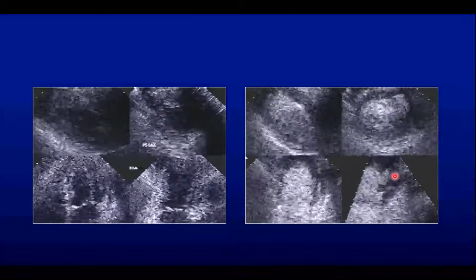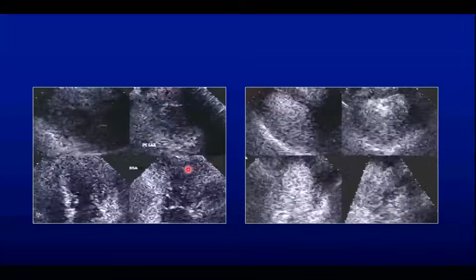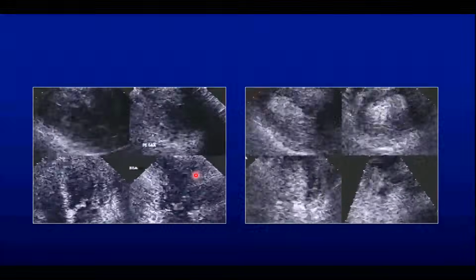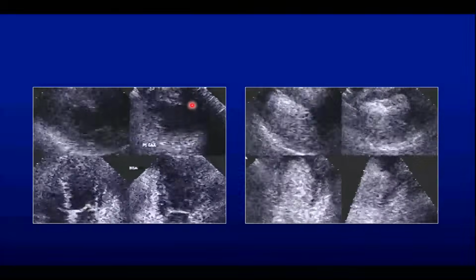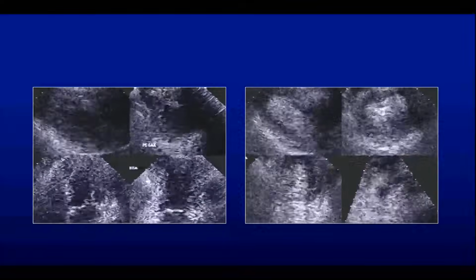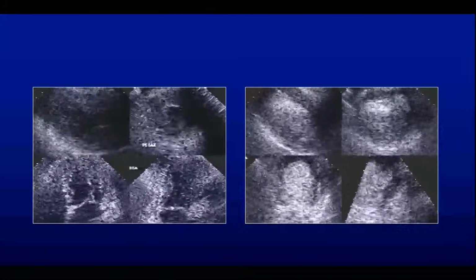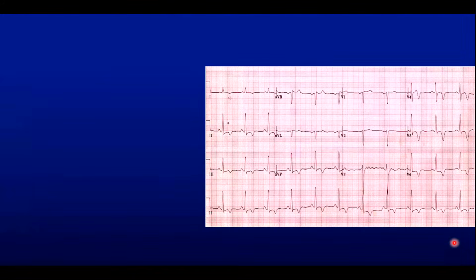You could see it right here, and right there. Our eye basically closed this gap, and this is where the abnormality was. And here, closed the gap, and this is where the abnormality was, right? So most of the time you'll be correct, but in certain situations you may not be. That's the situation here.